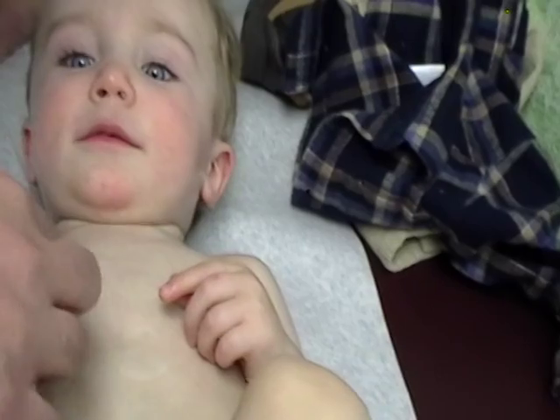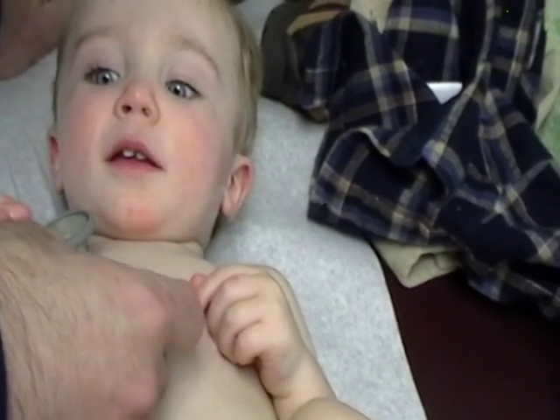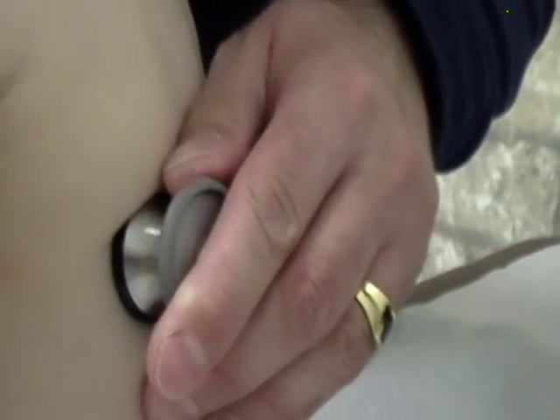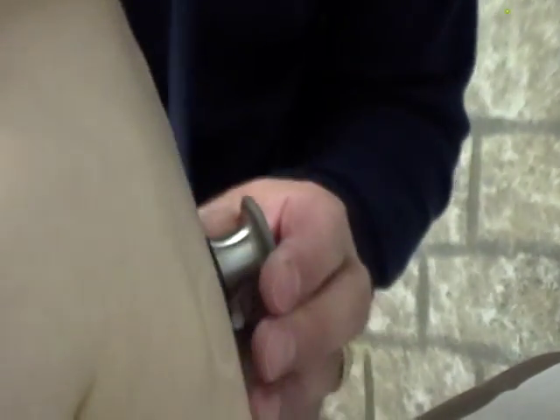We're going to auscultate over the major four areas. Because this is a child and they tend to refer sounds, you probably wind up auscultating in multiple areas. We will also auscultate the lungs anteriorly and posteriorly. Obviously, this is a child — checking for fremitus and egophony is not going to happen, because I somehow don't think he's going to say 99 for us.